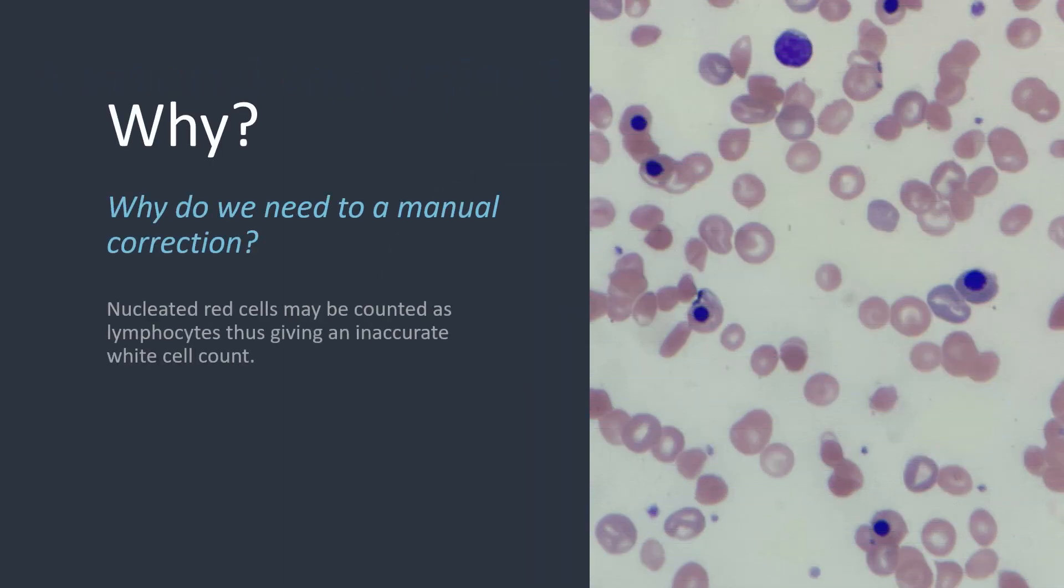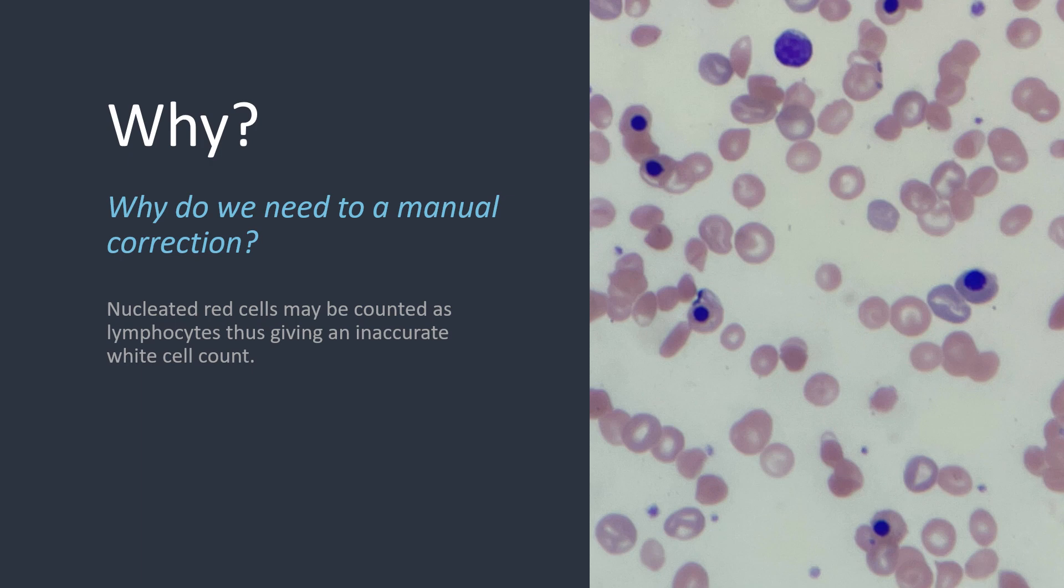Nucleated red cells are similar in size to lymphocytes, and the more immature that they are, the more likely they are to be counted as lymphocytes by the analyzer. If you think back to the performing a differential count video, you remember the individual white cells are a percentage of the total white cell count. So if you have non-white cells, in this case NRBCs, being counted, you'll forcibly elevate the lymphocytes and reduce the other white cells.